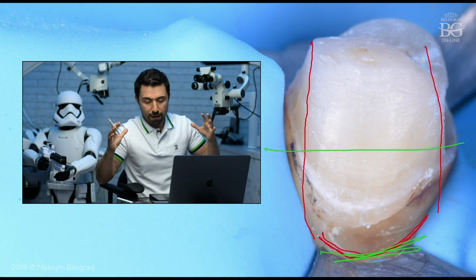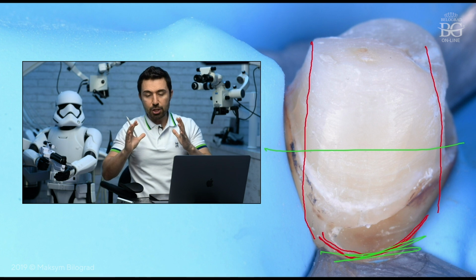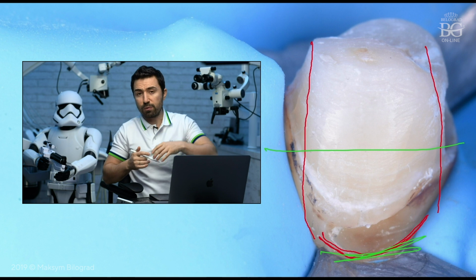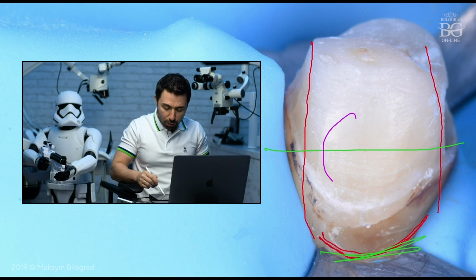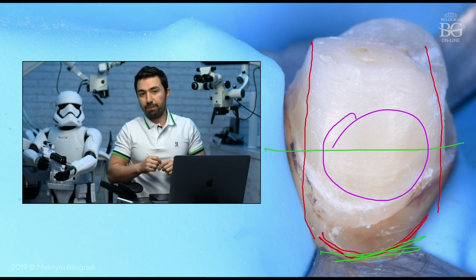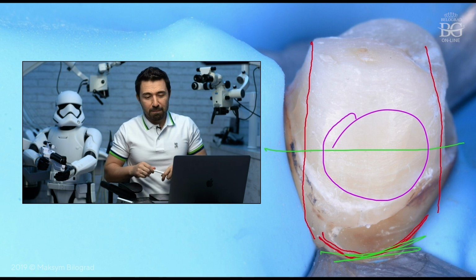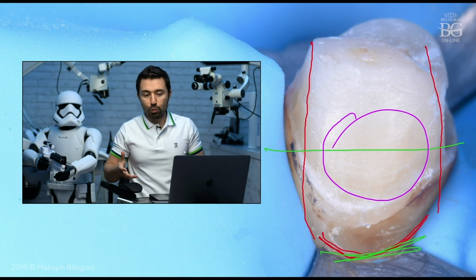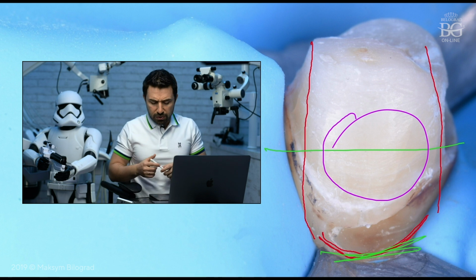So if I went that deep, considering the necessity of a tapered or conical preparation to get the proper pathway of insertion for the crown, and also a big bulbosity here, respecting 2 planes of crown preparation, I would compromise even the vitality of this tooth, because my preparation would be super aggressive all the way around. So I started to think, okay, what can I do in this case?